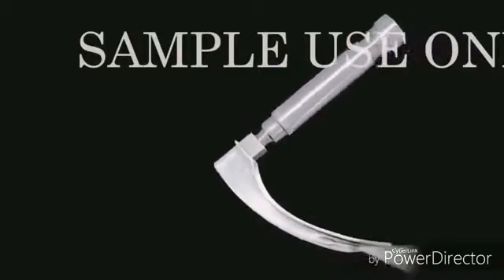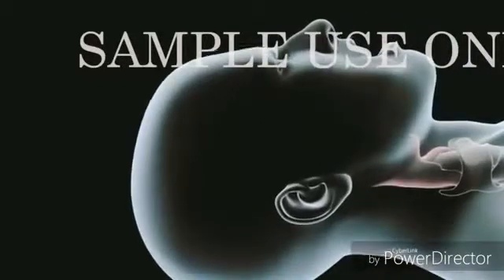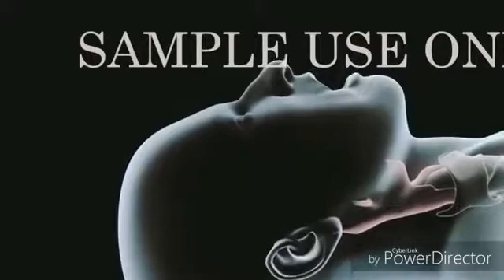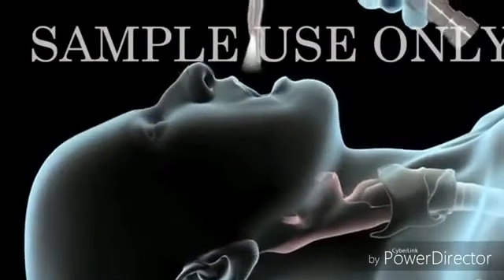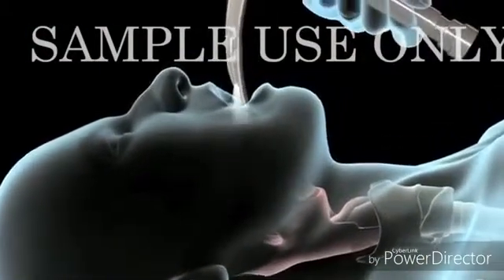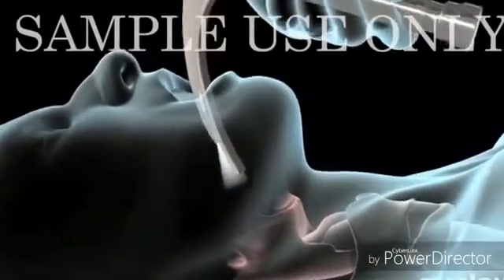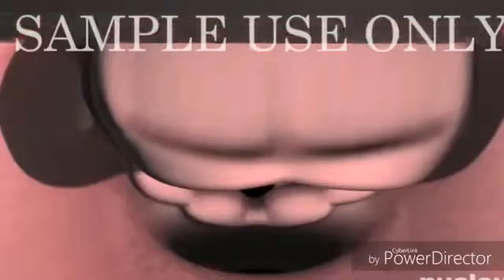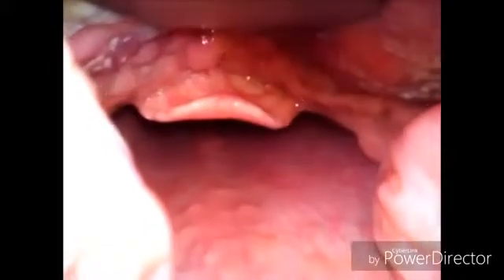Now we are going to start the process of intubation. To perform the process, slightly extend the neck of the patient. Now we are going to introduce the laryngoscope gradually, and as soon as you introduce the laryngoscope, you can see the uvula, tonsil, and the epiglottis, which is covering the trachea.